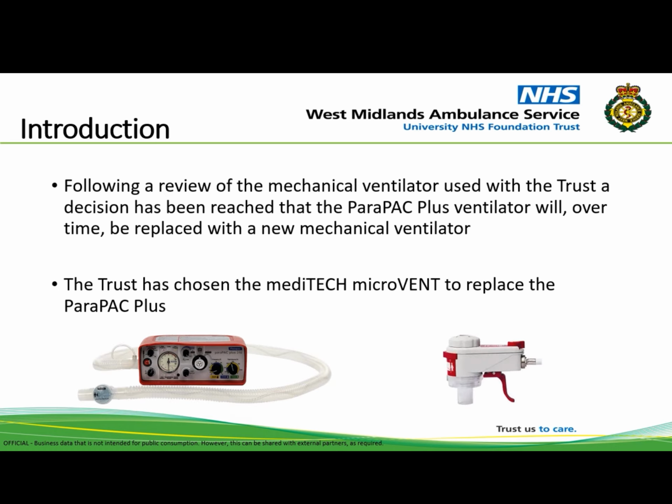Following a review of the mechanical ventilator used within the trust, a decision has been reached that the Parapack Plus ventilator, currently in use within the trust, will be replaced with a new mechanical ventilator. The trust has chosen the Meditech MicroVent to replace the Parapack Plus. The Meditech MicroVent is lighter and easier to use than the current ventilator.